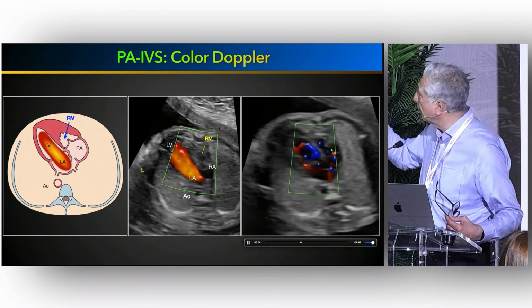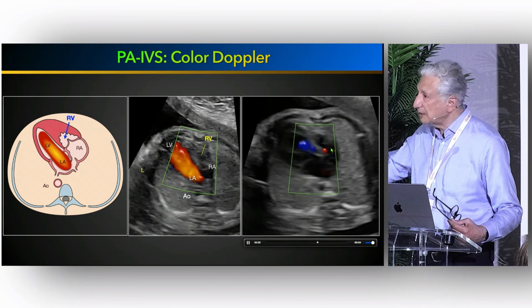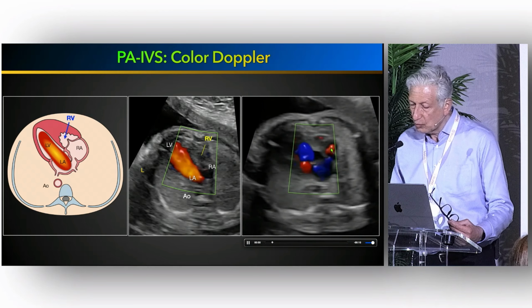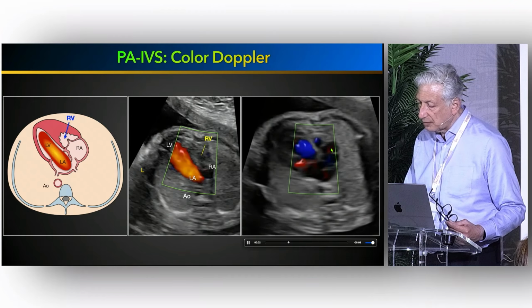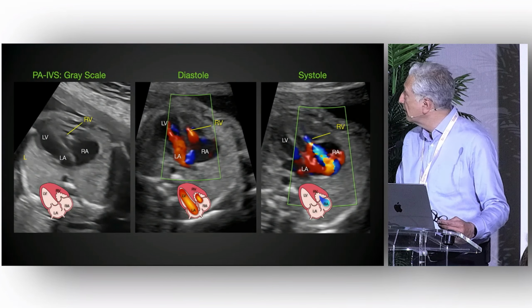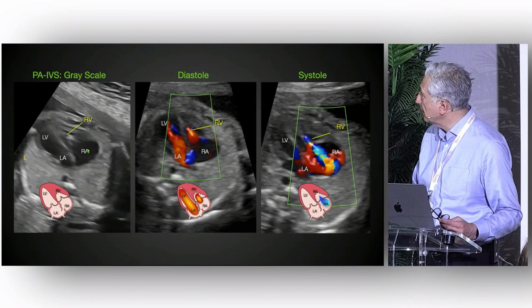If you put the sample volume there, you have often, especially in such severe cases, a single inflow peak instead of the double peak, like with the 2 E and A waves. And this is the other way when you see a small right ventricle with an echo.